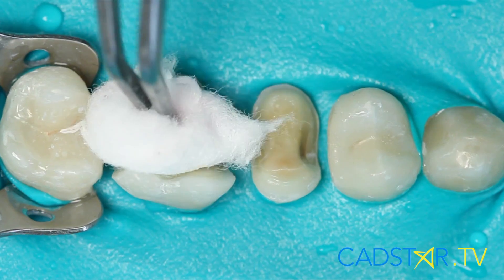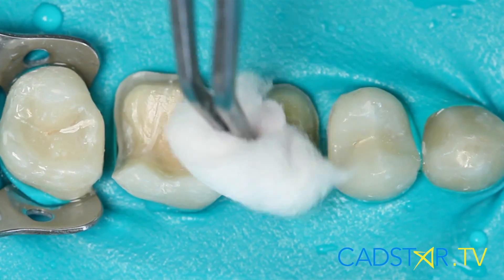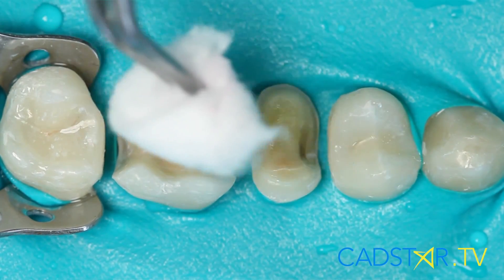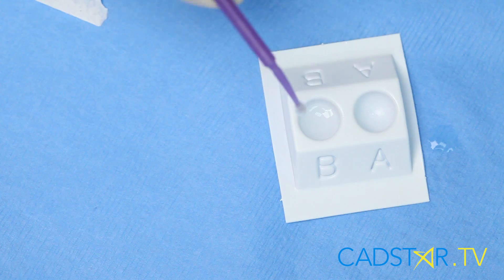Then we have the self-etch systems. They're great. Most people use self-etch — less probability of sensitivity. However, it's how we treat the dentin. We can't over-dry the dentin. During the impression period, we don't want to over-dry our dentin. We don't want to desiccate our dentin where the odontoblast gets sucked up that dentinal tubule and then all of a sudden you're going to have post-treatment sensitivity.